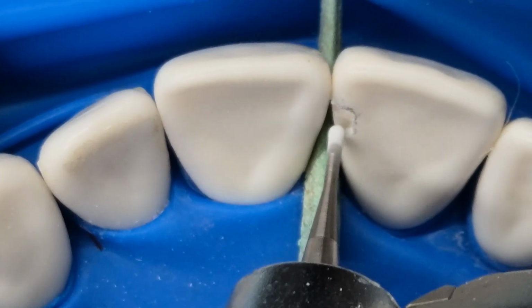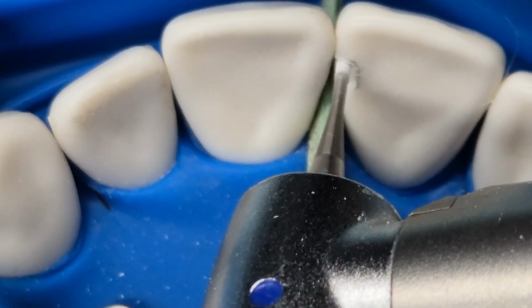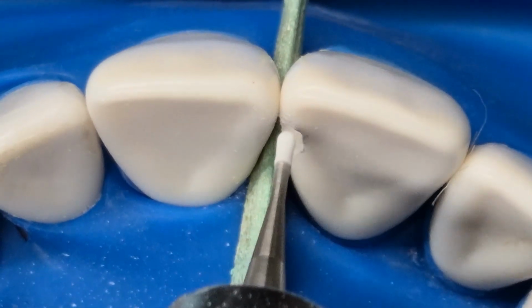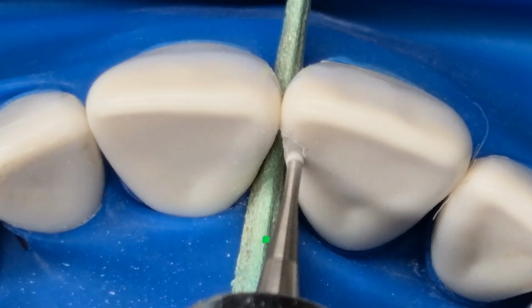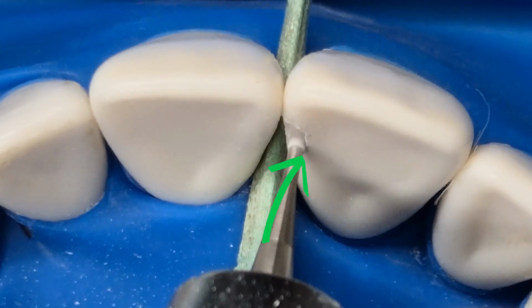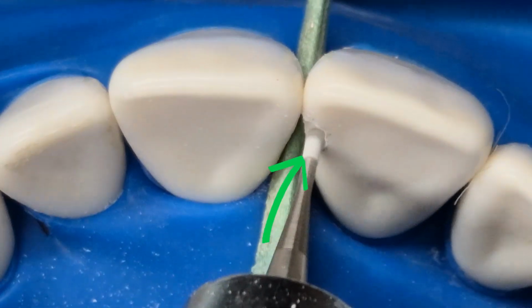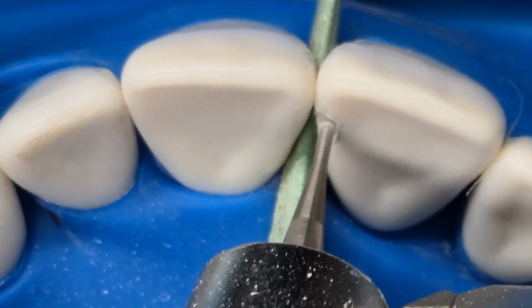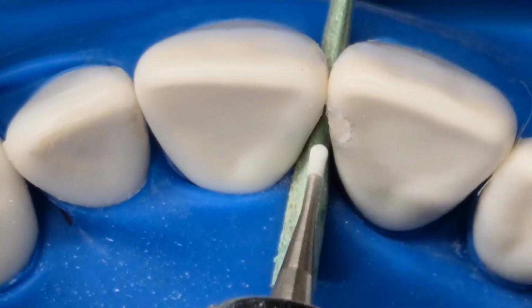One important note here, keep the burr rotation direction in mind to avoid injuring the adjacent tooth. For example, the burr will slip to the gingival embrasure if I move the handpiece from distal to mesial at the gingival wall of the preparation. Rather, move it in the opposite direction to avoid any injury.